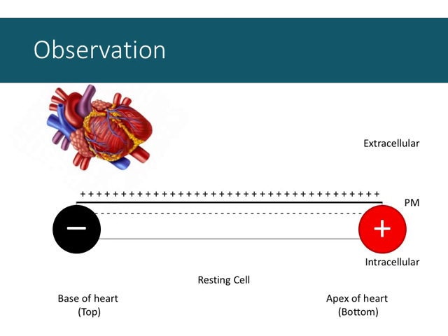So you've done lead 2 ECGs, you've done the propagation of signals before. We're recapping and putting it in this orientation. So apex of the heart at the bottom on the right, base of the heart at the top on the left. Confusing, but those won't change, which is good.